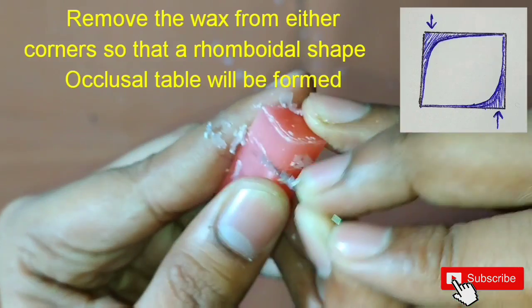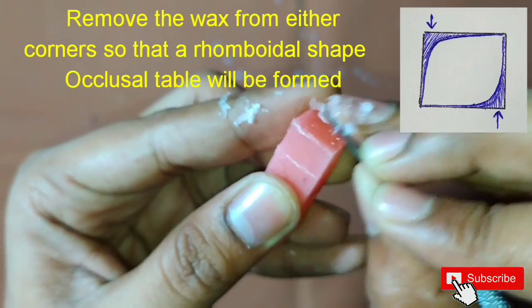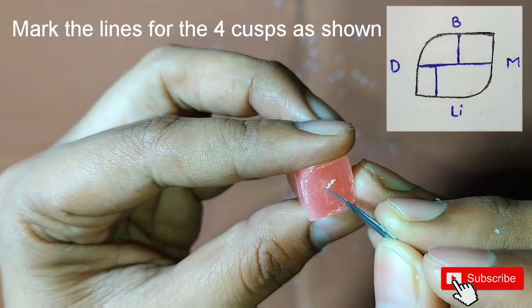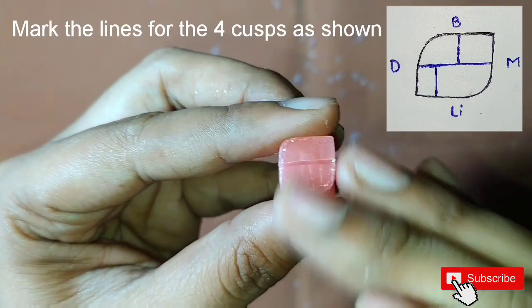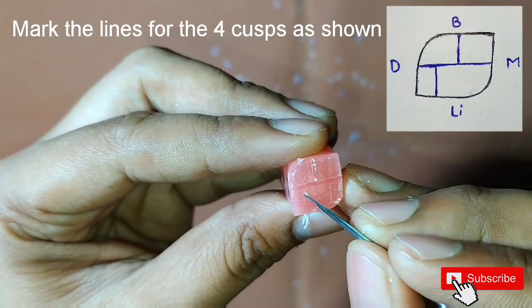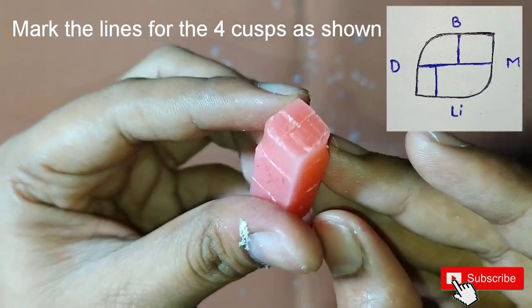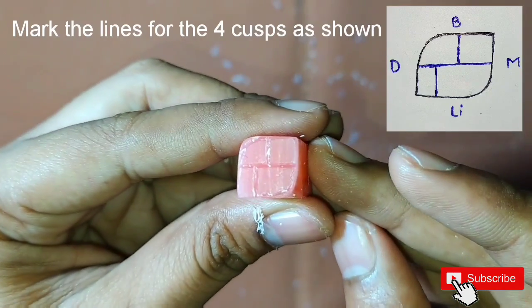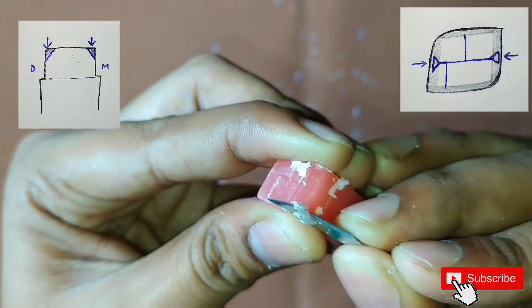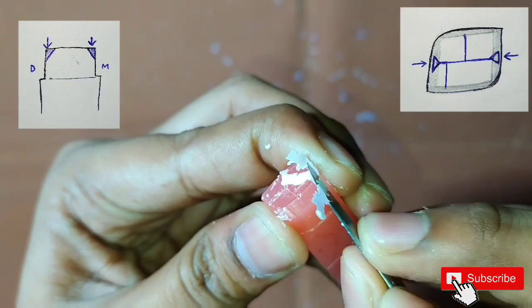Remove wax from the two opposite corners such that the rhomboidal shape will be formed. Look into the figure above and do the same. After this, we will do the marking for the cusps — do the marking same as shown in the figure. After this, we will start removing the wax from the upper edges to make the slopes. This will help us to get the height for our cusps.